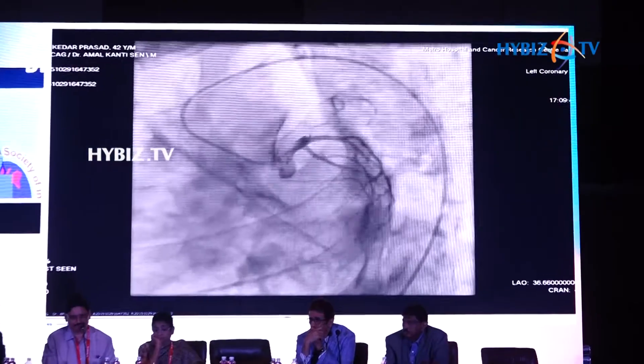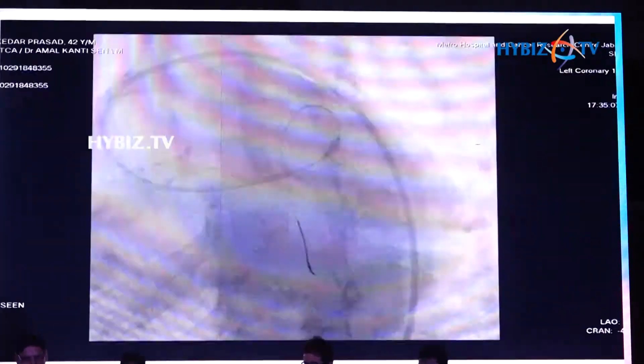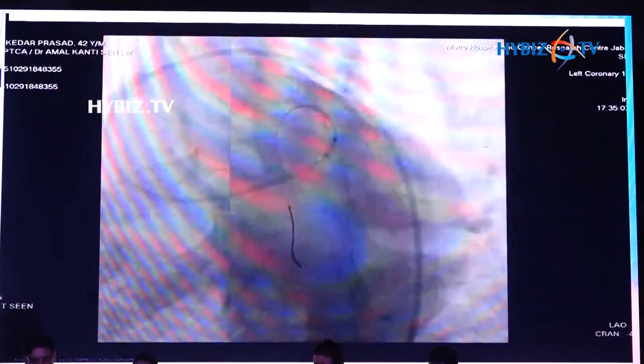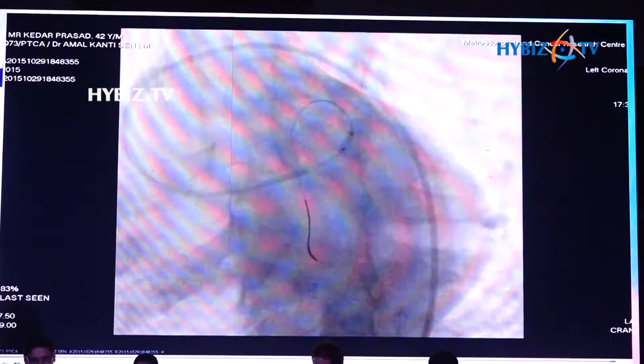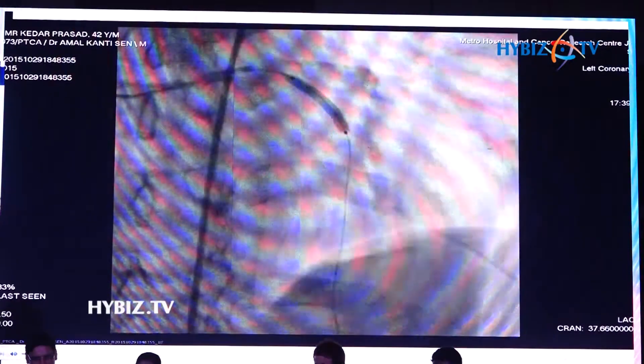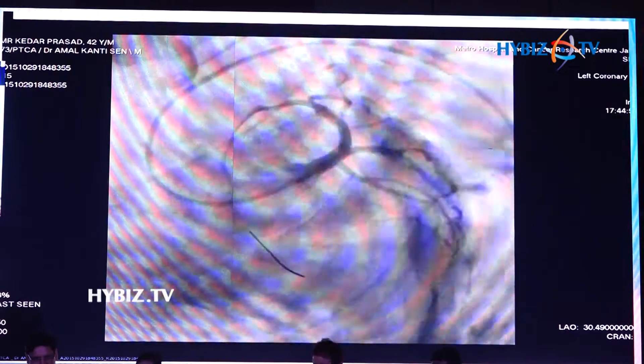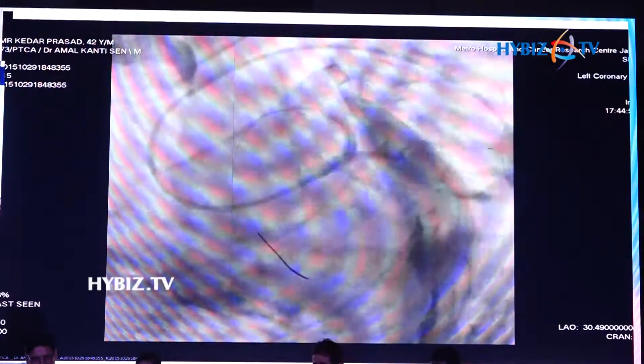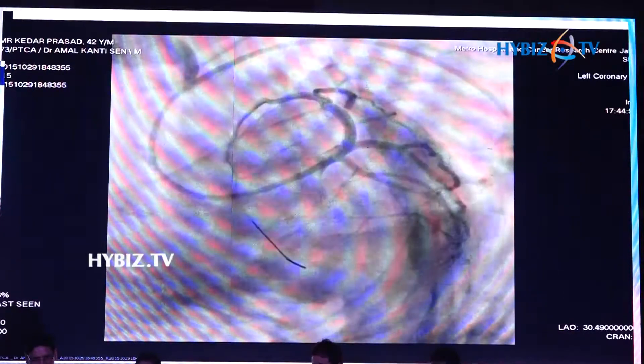He was stable, and the angiogram shows complete ostial LAD block. We actually did not do thrombosuction in the beginning — we just opened the artery and it looked simple. We opened it and then put a stent, and then you can see there is a clot between the LM and LAD.